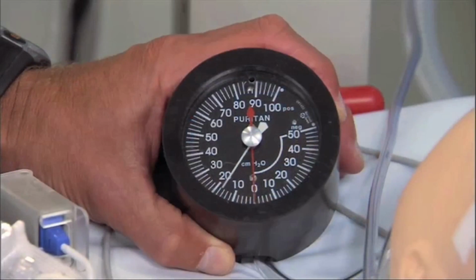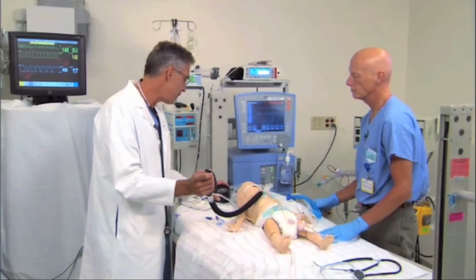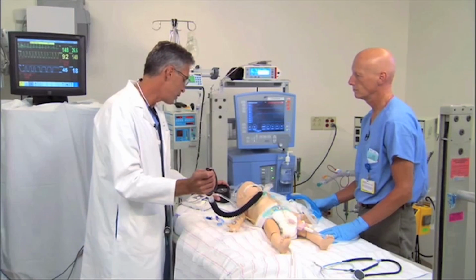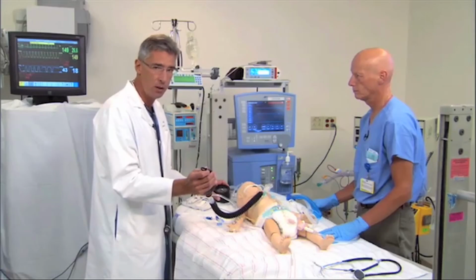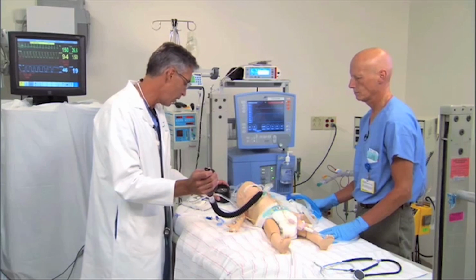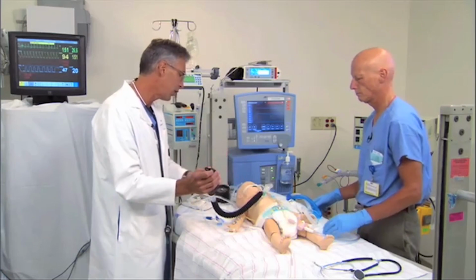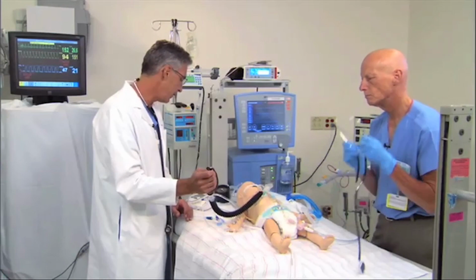So we have a manometer inline. I'm trying to manually maintain the same ventilator settings, which is virtually impossible, as you know. That's why we do have ventilators. But it's important not to completely de-recruit the lung as we are manually ventilating. So Barry, why don't you have a listen as I'm ventilating.